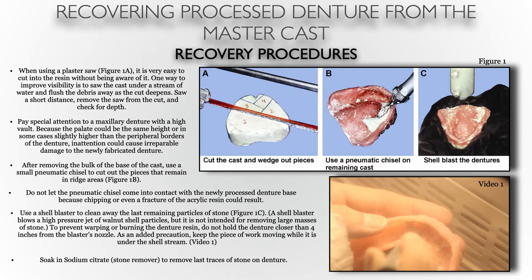After removing the bulk of the base of the cast, you can use the pneumatic chisel to remove all of the stone stuck within the undercuts. The pneumatic chisel is probably one of the best tools to use for this. Without it, it could cause a lot of issues — using a murphy knife and a mallet trying to chisel away the stone by hand can be very difficult.